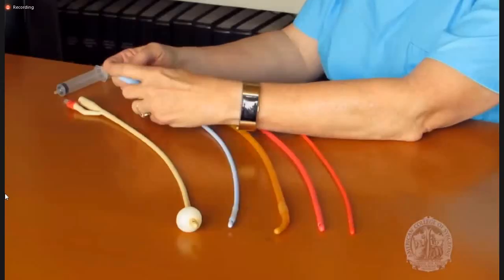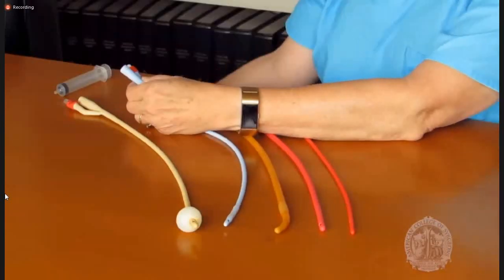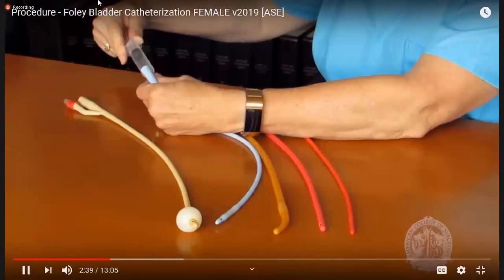On the external end, it has two branches. One drains the urine into the collection system. It's connected to some tubing and then to usually a bag, while the other is used to fill the balloon with sterile water. We would put it in here like this and blow up the balloon. Be sure to check the number on the ring at the end of the catheter, because that will tell you how much volume to use when filling the balloon.